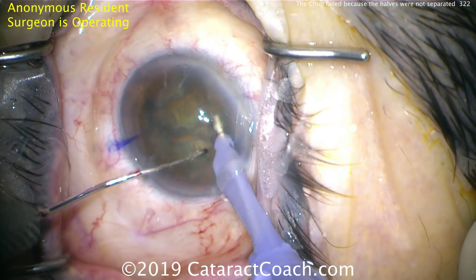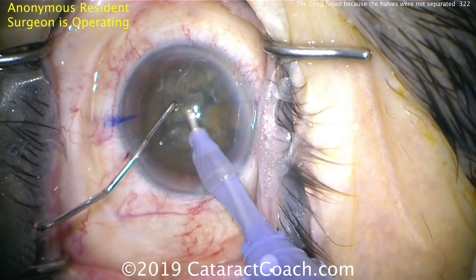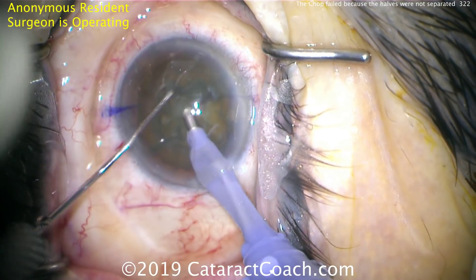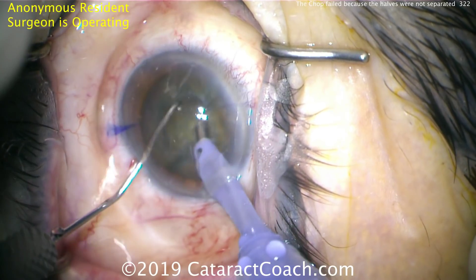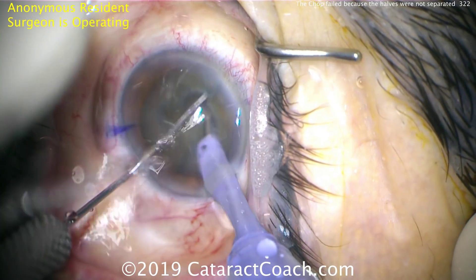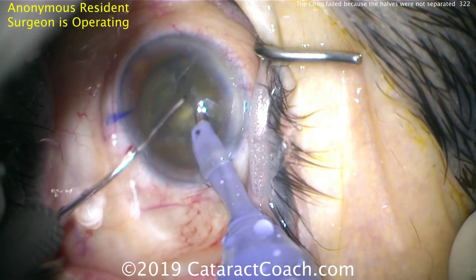These halves need to be separated, and the key move now is to be deeper within the groove. Trying to take out a hemi-nucleus at this point is premature. As the surgeon buzzes into it, it's difficult to bring the piece out of the bag because that half is still connected to the bottom. The nucleus is partially split, but it needs to be fully split in order to bring out one half.